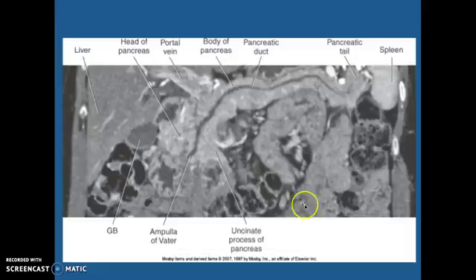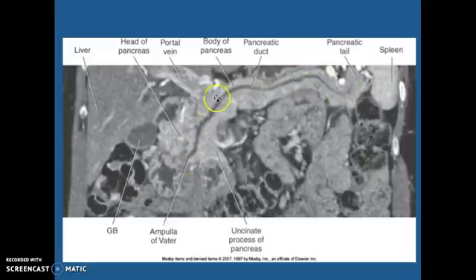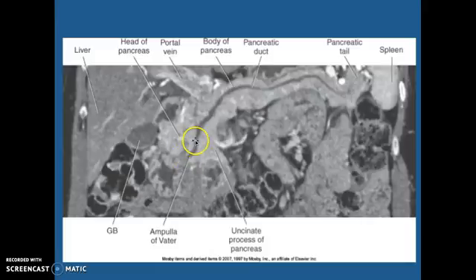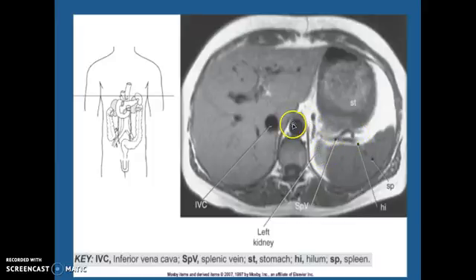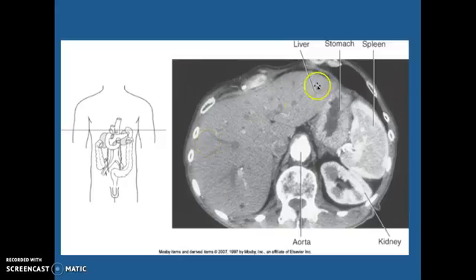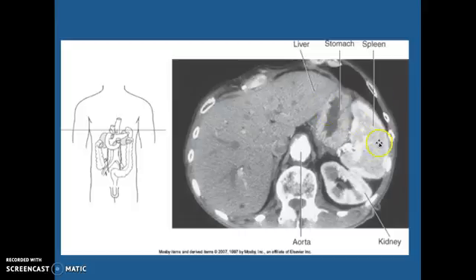This is a great picture of the pancreatic duct. They had to reformat it so they could get the whole thing, or angle it just right. Your ampulla of Vater is there and it's coming up. We don't see the common bile duct because of the way the angle is. Stomach with food in it. Here's the spleen, the hilum. This is your vein and the artery is the one that curls. Left kidney is right there. This is aorta and inferior vena cava. This whole thing right there is your liver. This is an angio — you see your aorta here, nothing in the inferior vena cava. Stomach. Here's your spleen and here's your left kidney.